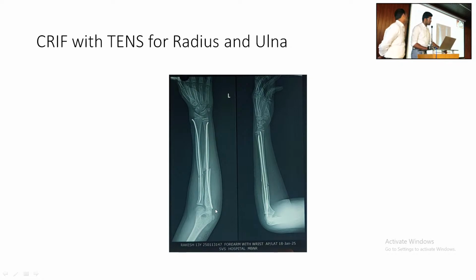Can we go through the physis or not? No, sir. How did you go from there then? Is it through the physis or from the lateral or medial side? Medial side, sir. Medial side or lateral, whatever. It has to go from the side. That is the reason, not through the physis or physeal cartilage. Good. Medial is ideal.